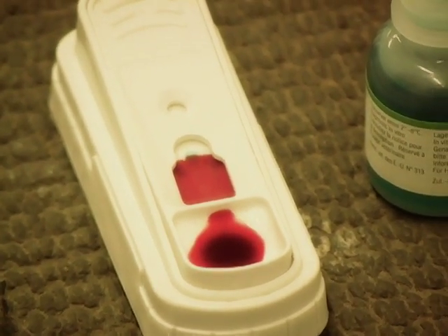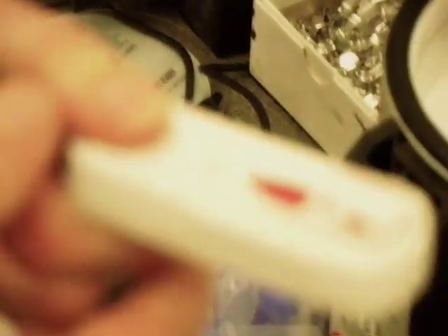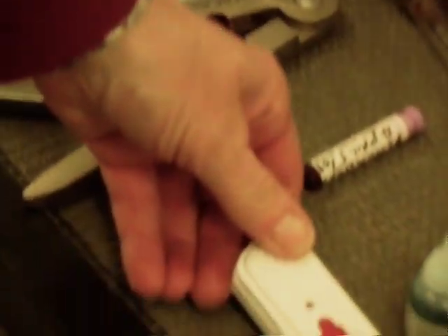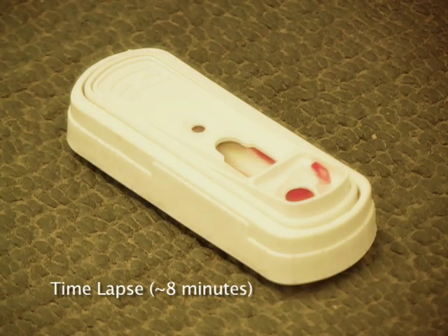Once it gets to the top well, you're going to snap it down — it's a SNAP 4D test. As the blood recedes back to the well, you will see whether it's negative or positive.